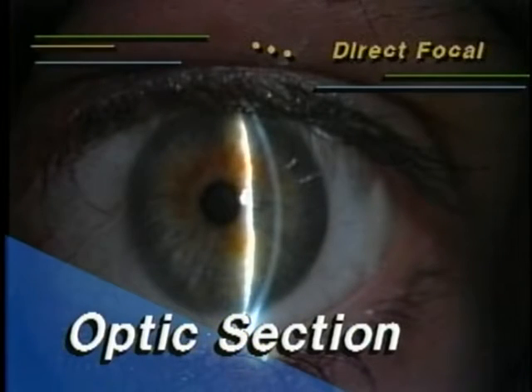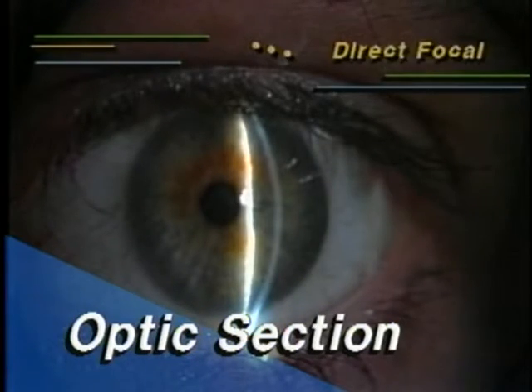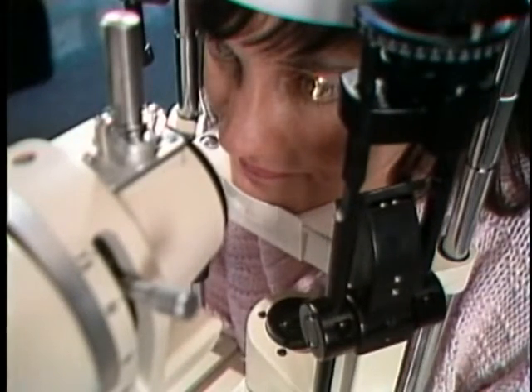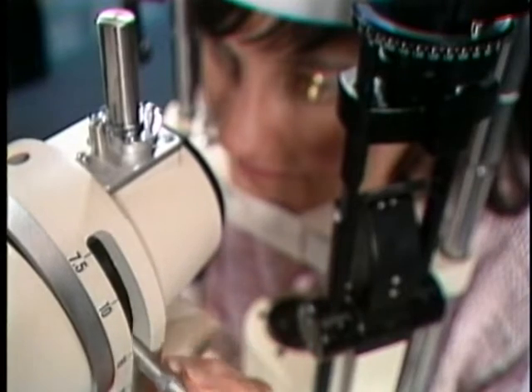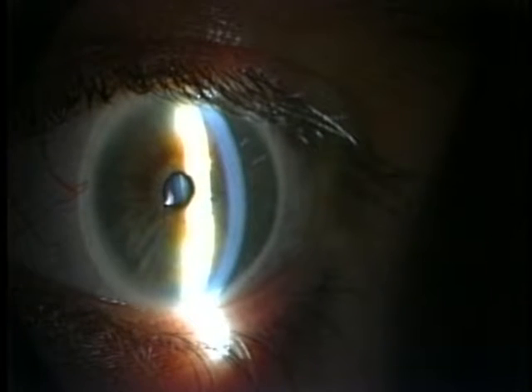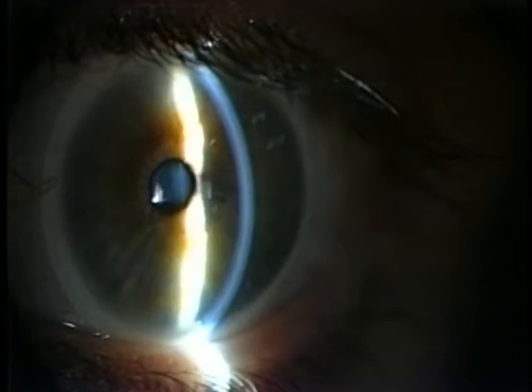A parallel piped is transformed to an optic section by narrowing the slit width to a thin slice. The angle between the light source and microscope is about 60 degrees, with the magnification at a medium to high setting. This illumination is generally used to view a cross section of the cornea and helps to differentiate the various layers, including the epithelium, the stroma, and the endothelium.